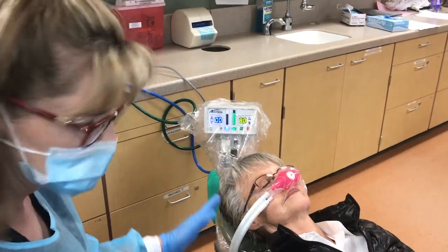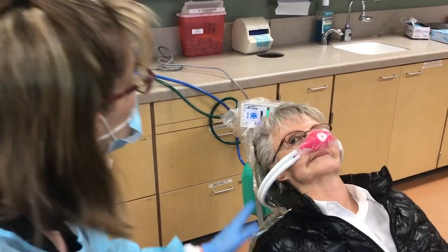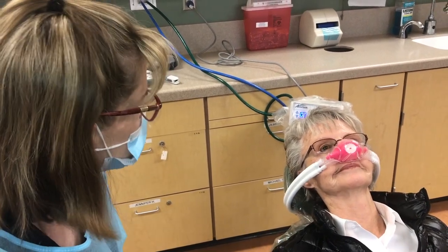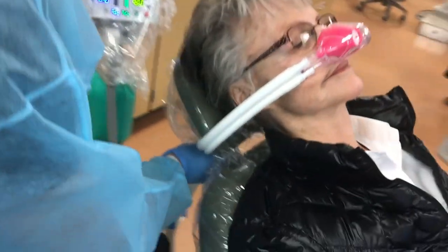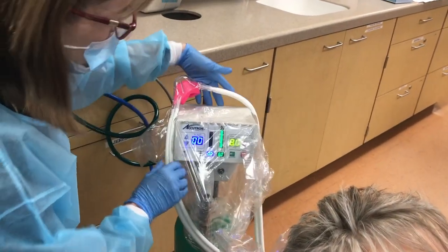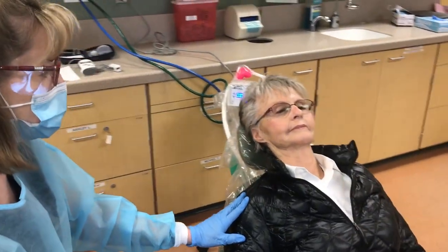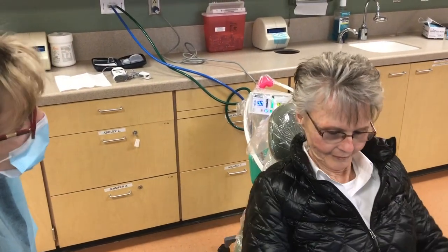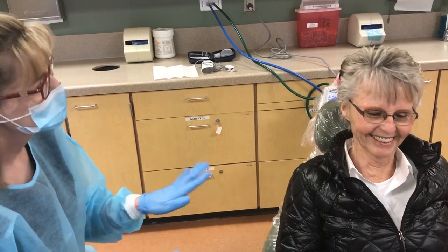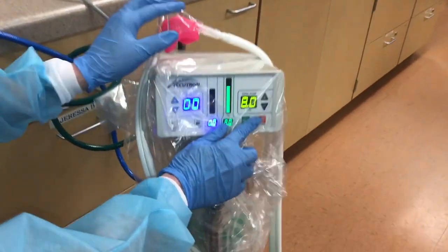Once the patient has had a minimum of five minutes of 100% oxygen for recovery, ask them if they are feeling recovered, alert, and oriented. If that is the case, set them into semi-supine and ask again if they still feel fine. If so, loosen the tubing and remove the nasal hood. Please keep the oxygen flowing and the nasal hood ready in case there is any reason to reapply. You will then sit the patient into the fully upright position and ask them again if they feel recovered, alert, and oriented. These are two important words you will add to your legal documentation in the patient's chart. Once that is confirmed, you may turn off the unit.